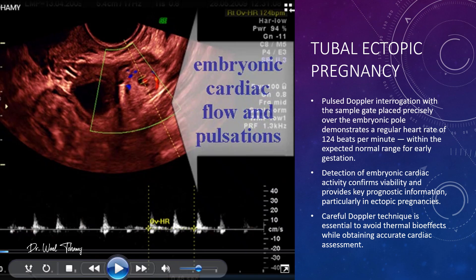Here we have a pulsed Doppler trace with the sample gate placed precisely over the embryonic pole. You can see a regular heart rate of 124 beats per minute, right in the normal range for early gestation. The detection of embryonic cardiac activity confirms viability and gives us important diagnostic information, especially in ectopic pregnancies. When using Doppler in early pregnancy, keep your exposure time short and your settings optimized to minimize thermal effects while still getting an accurate cardiac assessment.